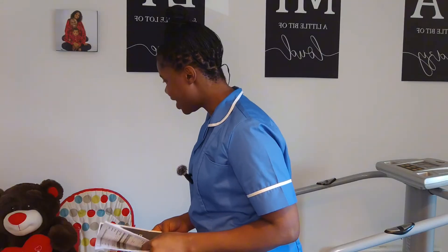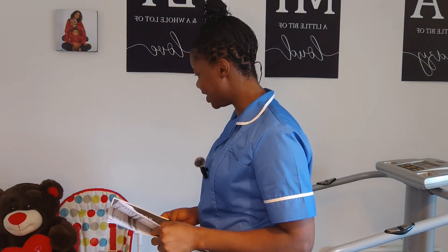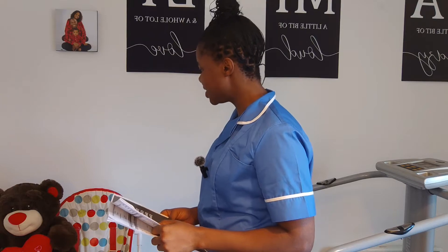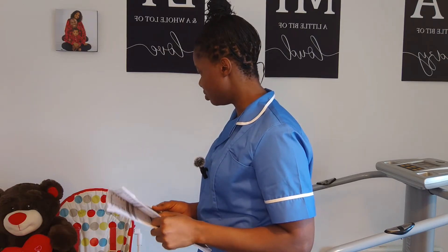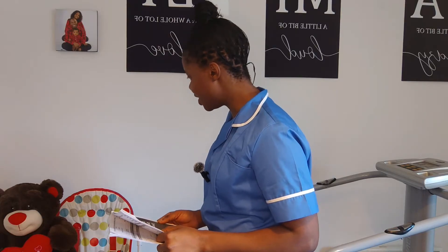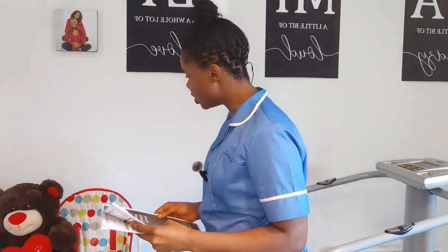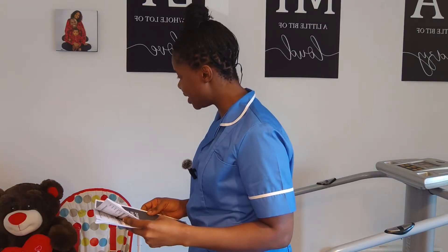As I approach my patient: "Hello, I'm Kenny, one of the nurses that will be attending to you today. How are you? The reason why I'm here is to administer your prescribed insulin. Is it a convenient time? Thank you. Before we continue, could you please confirm your full name and date of birth while I double-check with my paperwork?"